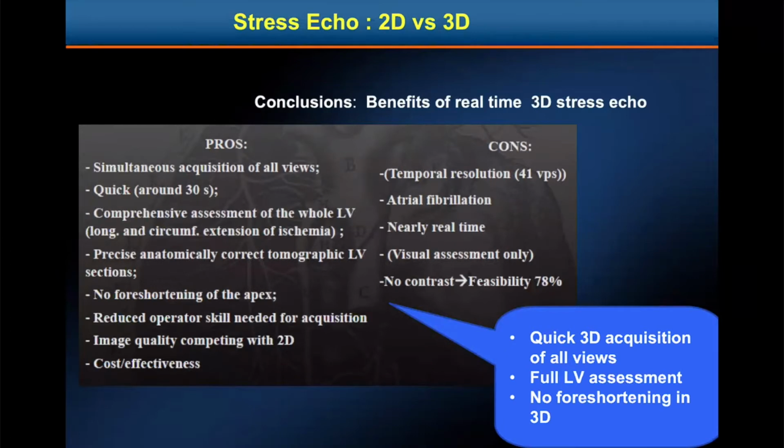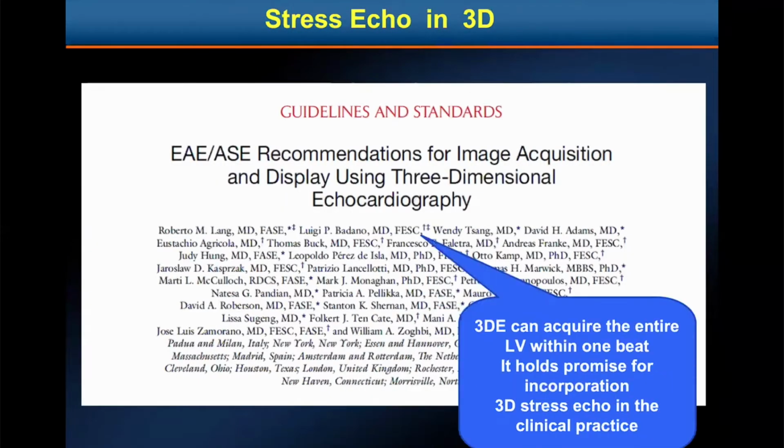So, the quick acquisition of 3D for all views, the full volume assessment, is better when we use three-dimensional echocardiography for stress echo in clinical practice.